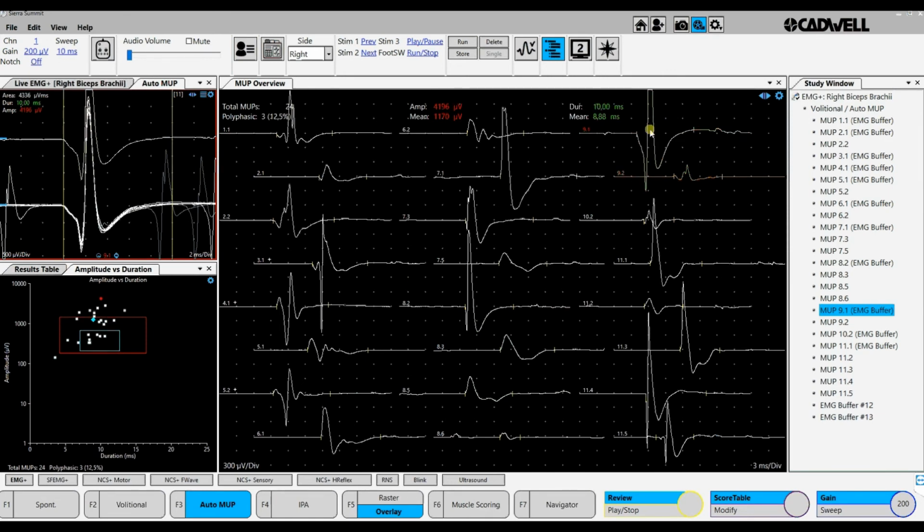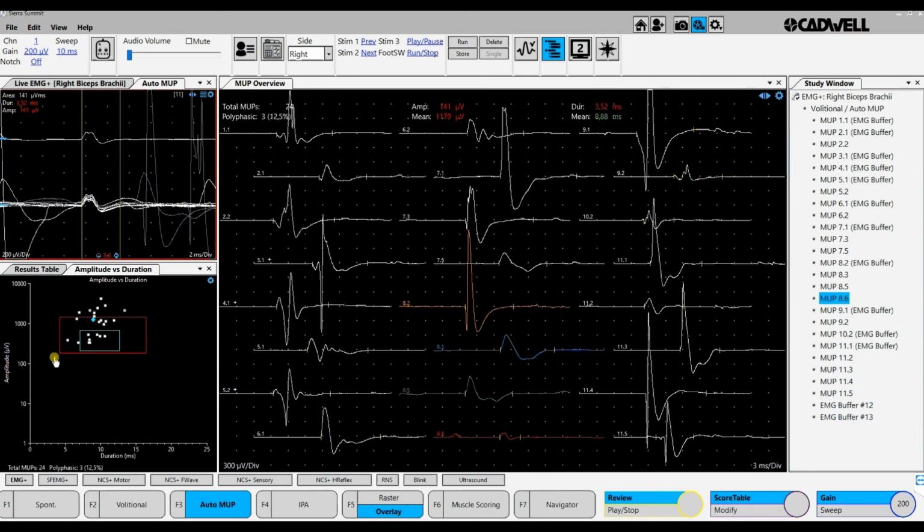The colored signals are recorded from the same insertion point, and the red one is representing the dot. And here I take this small signal, I press on that, and these are the 4 signals that we obtained, and this little one is the representing one here.